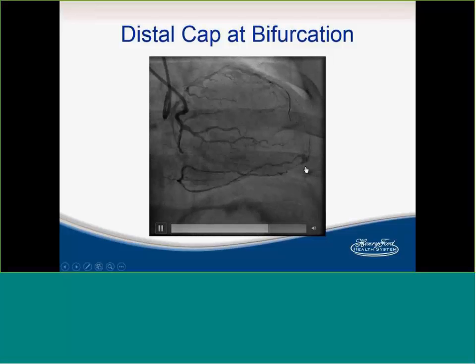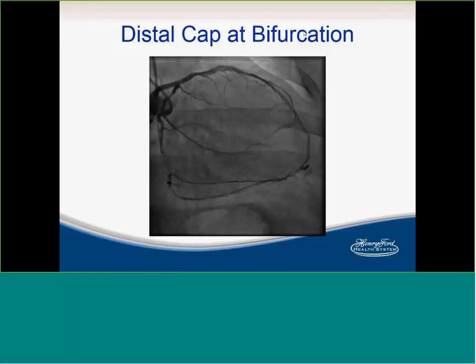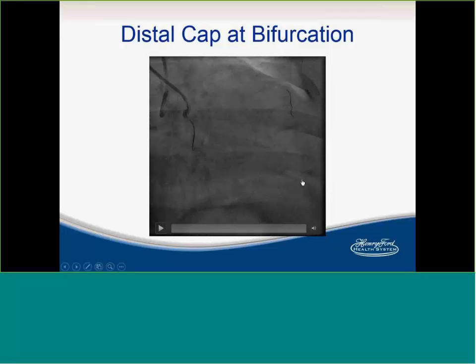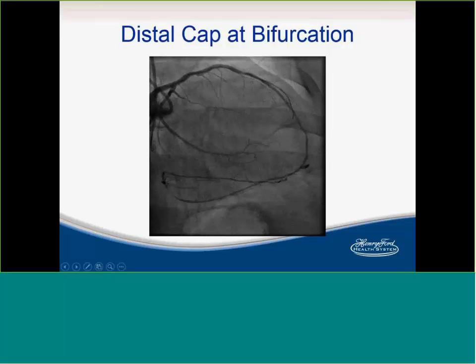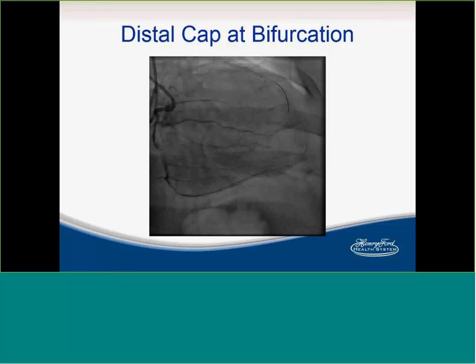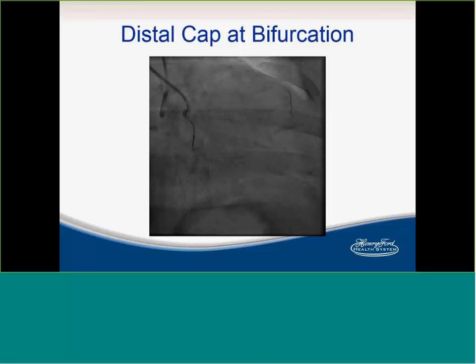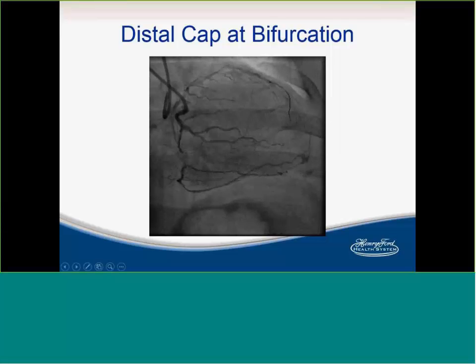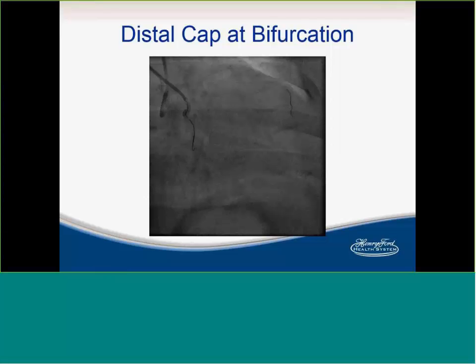Three years ago, I would not call those interventional collaterals because I would not go in a virgin chest. I would not go epicardial collaterals. I normally pick the septal collaterals. But at this stage, I actually start calling those interventional collaterals, and I feel so comfortable going through them. I would not advise anyone to go through epicardial collaterals first time without a proctor or without previous experience with the septal collaterals. First time should also be in a chest that's post-CABG, so there is not much pericardium to bleed into.